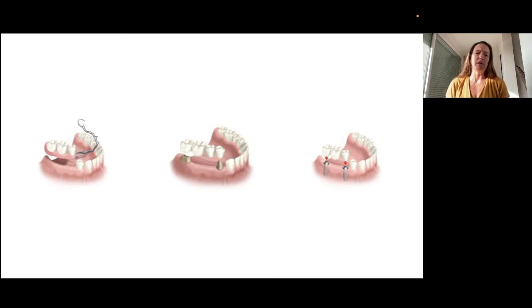Although people have a lot of difficulty in adapting to it, because it's something that is removable, it's constantly moving inside the mouth, and also it will basically accumulate more bacterial plaque, which is not good for the patient.